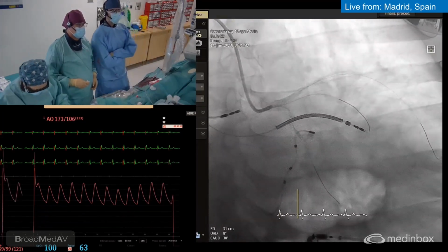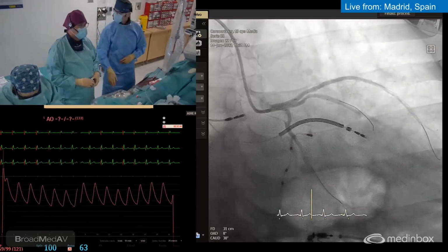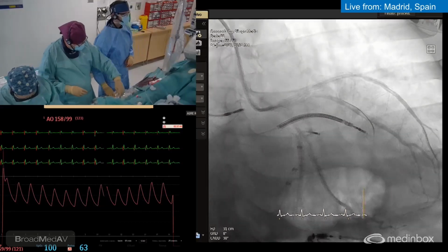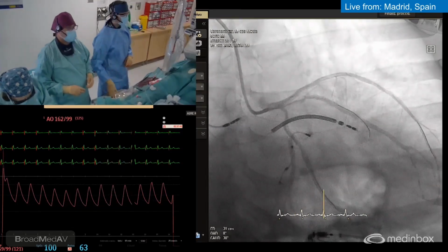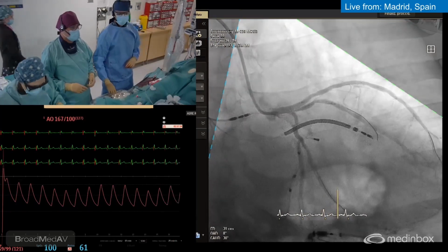It's quite good. Let's do the spider and then an IVUS. Dame para TCA que me preocupa.